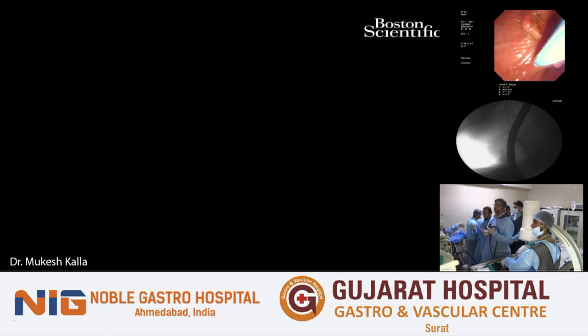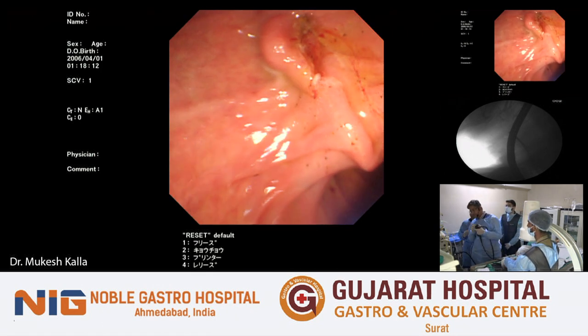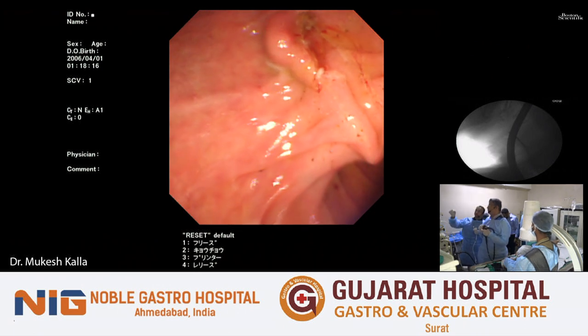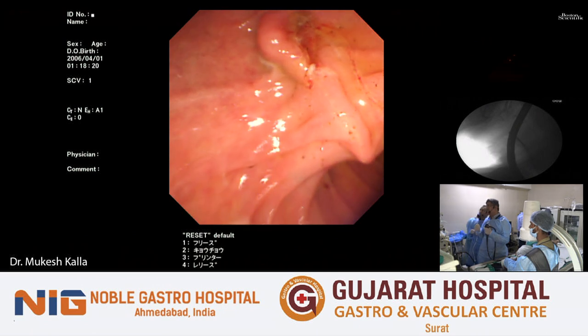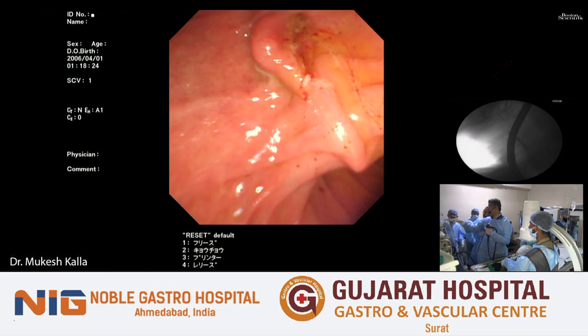So Dr. Kala, always you use a wire once you come out. Suppose you have cleared a stone out of the CBD. Again, for introduction of the scope, suppose you will use a wire? No, I don't want to use the wire at all. I want to preserve this scope for a long time. Okay, so you will use a wire, right?